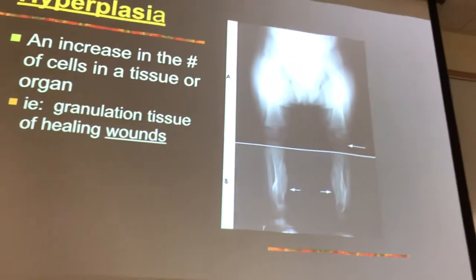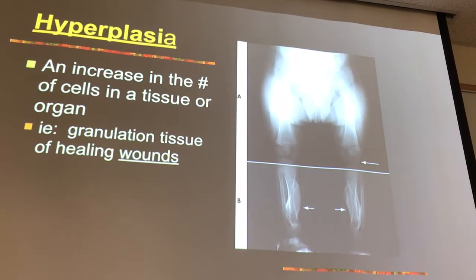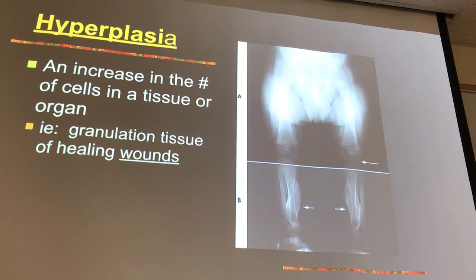Correct? Now you have to decide, did I not use enough mass or not enough kVp? All right, you getting the idea how this works? I hope I'm taking some of that confusion out, because I got a funny feeling most of you don't know what the heck I'm talking about. Right? We're going to get there. Are you saying we would increase both technical factors? Oh, okay. Do we increase both? Come on, how many times have I come in contact with you in this class? Six, seven of you? Why don't we increase both? We talked about this. Dose?